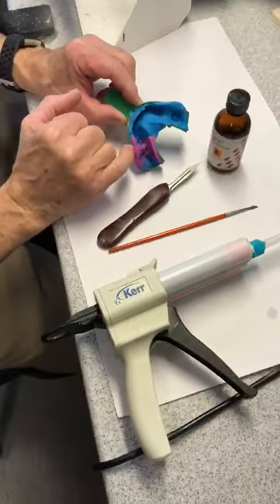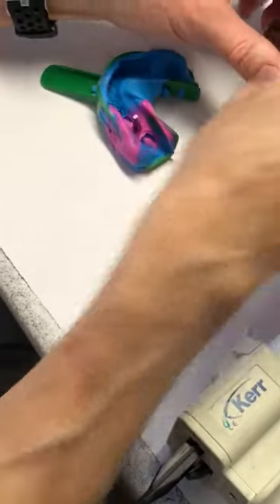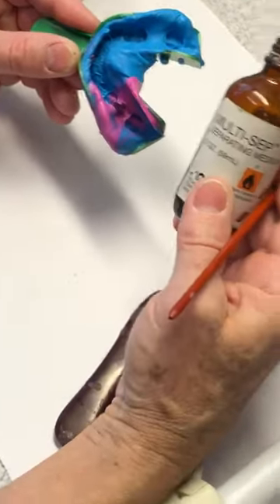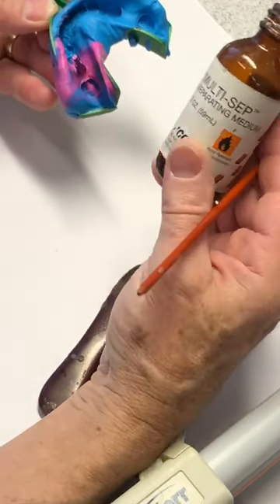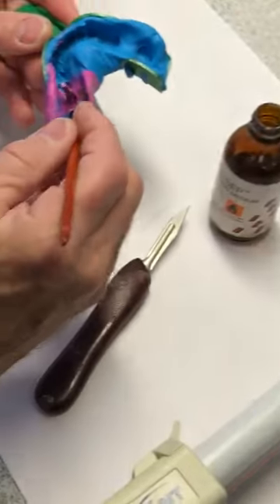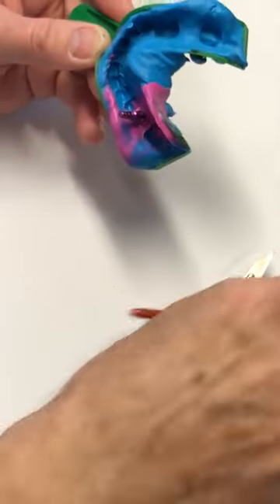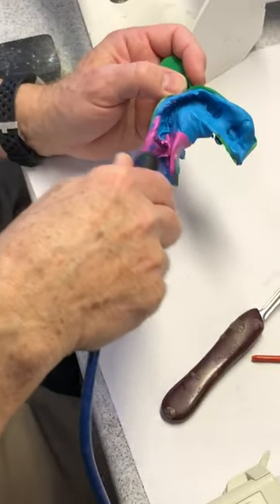We're going to put the soft tissue material around this implant analog. First we need to put some separator on so it doesn't stick to the VPS. This particular one is by GC, which is called Multisept. I'm just going to paint it in. I don't want any puddles or anything, so I'm going to air dry it just a little.